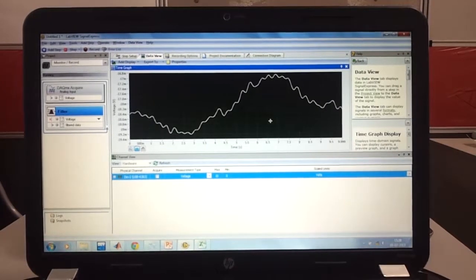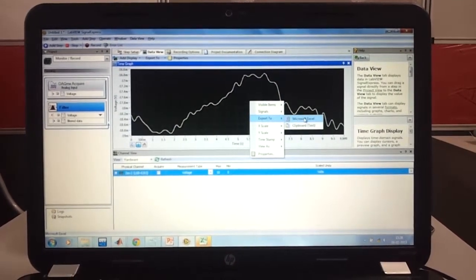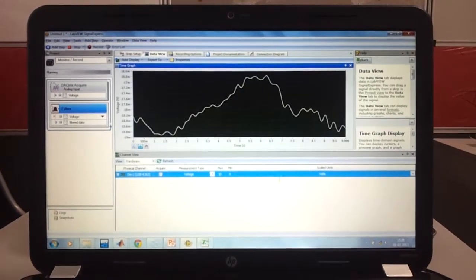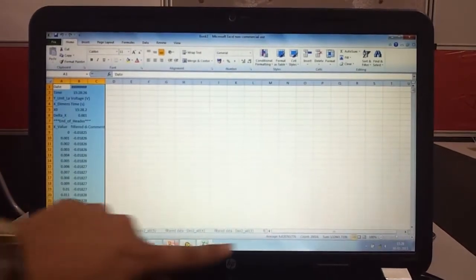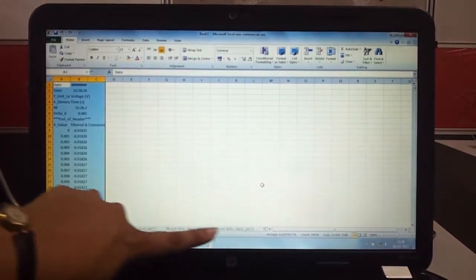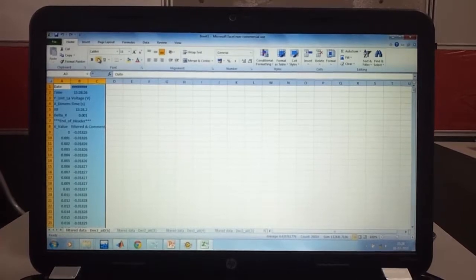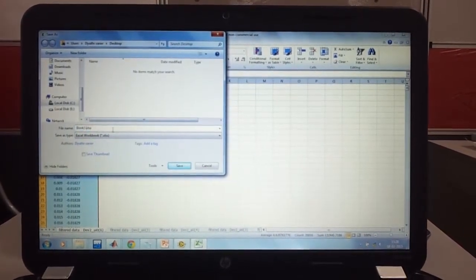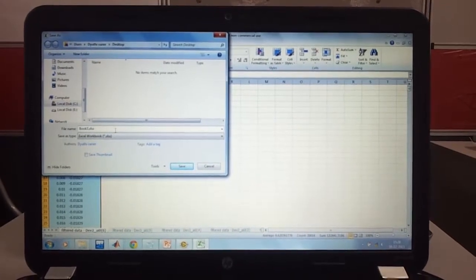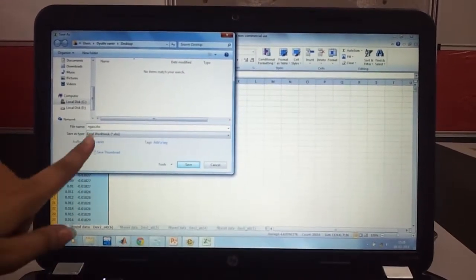This is how the person views from right to left. Because of the electrode placement, if the signal is above threshold, it means that the person is looking left. Otherwise, if it's down, it means the person is looking right. As you can see, there are different sheets where I've saved the 10-second frames, and now I'm saving the Excel file as NGAA.